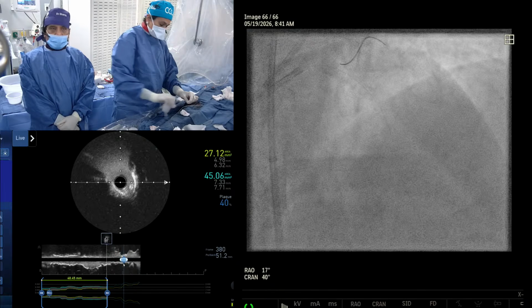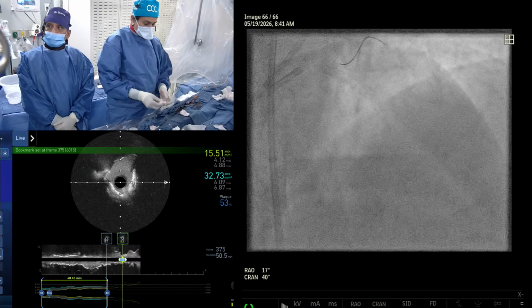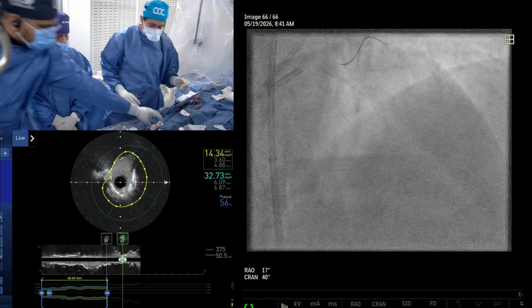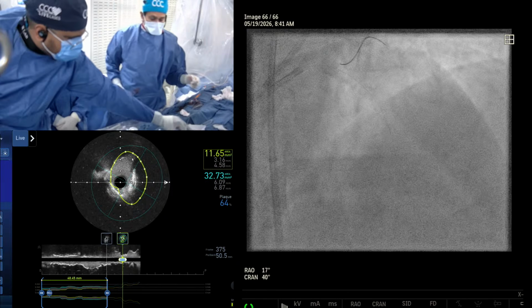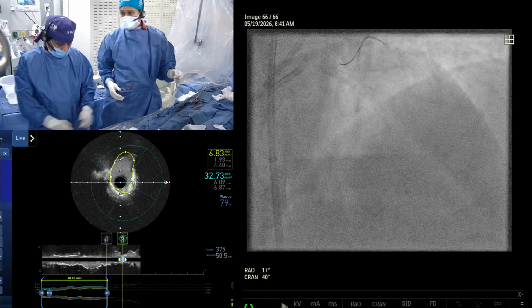One thing is that they're also saying that even if there is a non-calcified area, like a long lesion in between tandem lesions, if you're doing IVL, nothing happens in the non-calcified area. But I think that's not what we are seeing.